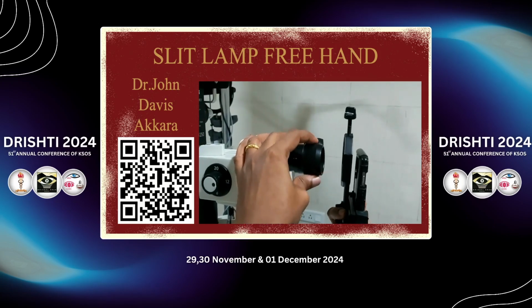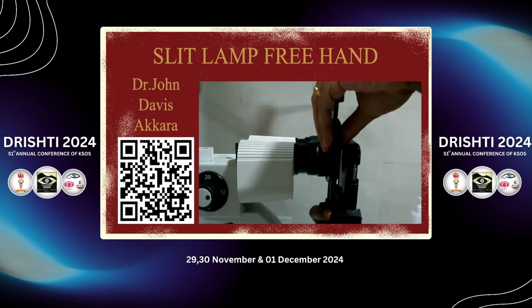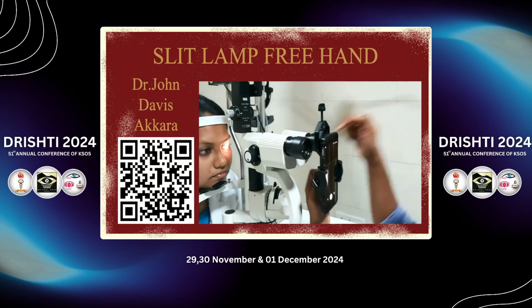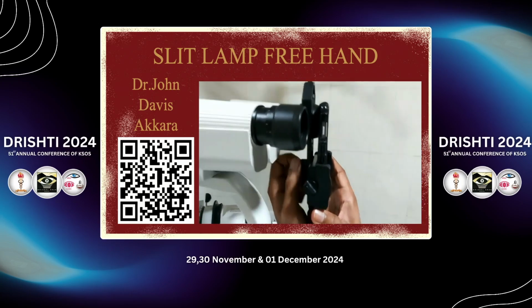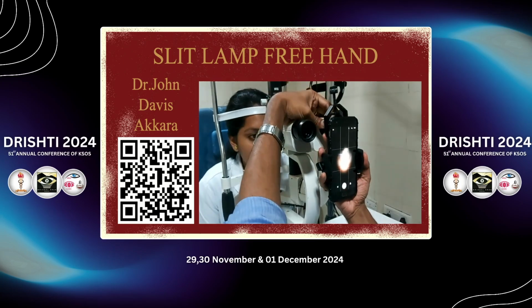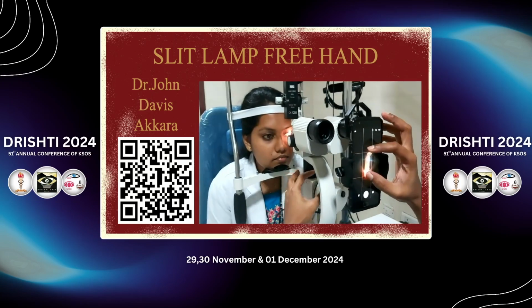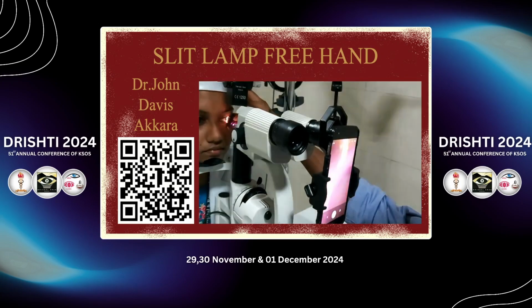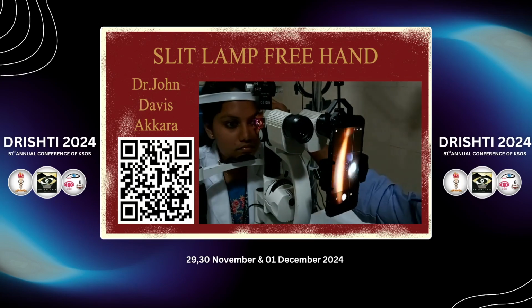Then you put the eyepiece. If the eyepiece has that circular thing which you can pull back, then very good, pull it a little back and then put it onto the eyepiece. Then I'll just show you, there should be a gap. It should not be 0, it should be a gap, and the correct position is when that circle of illumination is seen.